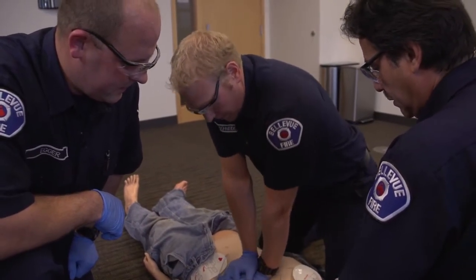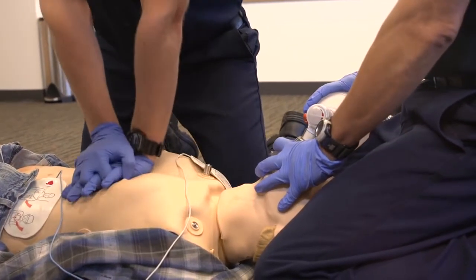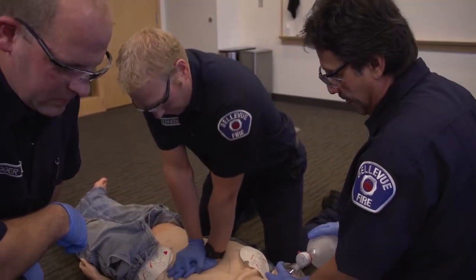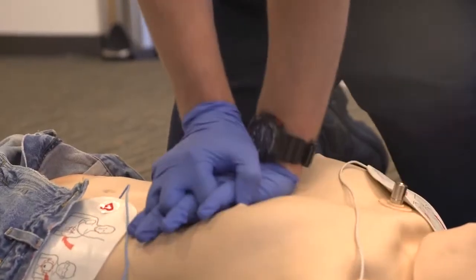20, 26, 27, 28, 29, 30. You've got a good respiration zone there. 20. We've got good respirations on that.